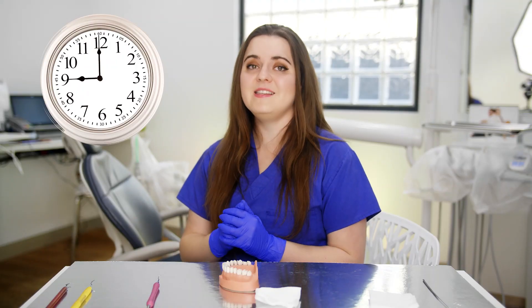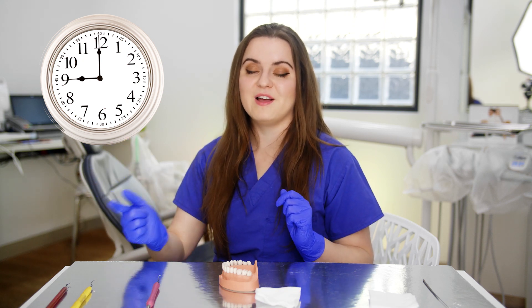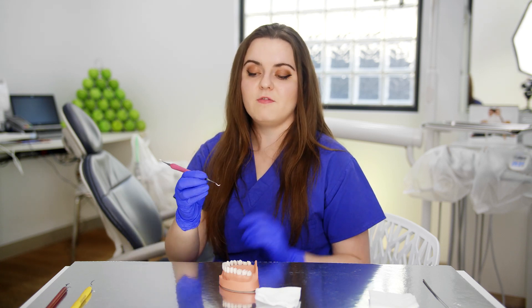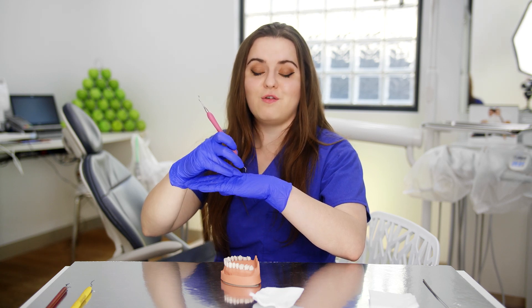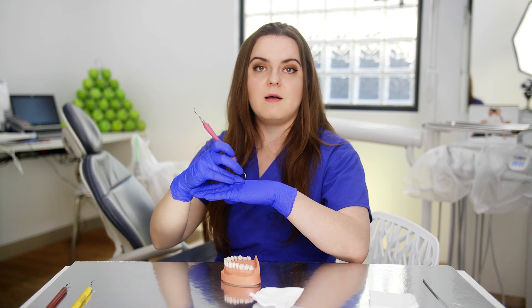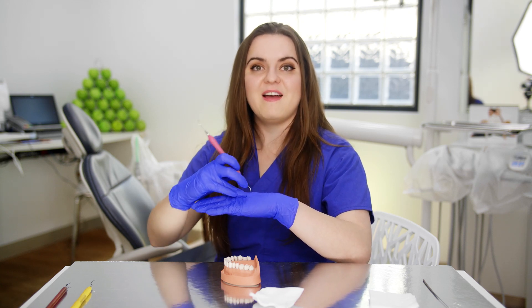The other good reason to move around is that quite often you'll think you've removed all the calculus from the lower anteriors, but go to 9 o'clock and have a look because quite often you will actually have missed areas. Another way to make sure that you don't fatigue yourself is to make sure that you use your whole arm and your body to remove the calculus — don't do finger flexing. Finger flexing is when you've got the fulcrum and instead of moving your whole arm and shoulder, you're just doing this with your fingers. Your hands and fingers are going to be absolutely exhausted. So use your whole arm and your shoulder to remove the calculus by pivoting against the tooth, leaning on that fulcrum. That's how you remove the calculus.